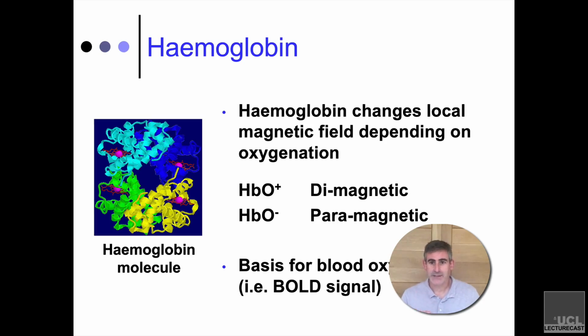Think about what iron does in a magnetic field. This is getting back to when you were in high school playing with magnetism for the first time. One of the things that they always show you is they give you a little bar magnet, some paper clips, and some iron filings. Now, if you just play with the paper clips and the iron filings, of course they're not magnetic, it doesn't do anything. But as soon as you touch that paper clip to the magnet, the paper clip itself becomes magnetic, right? And then that paper clip attracts the filings. This is exactly the same principle.